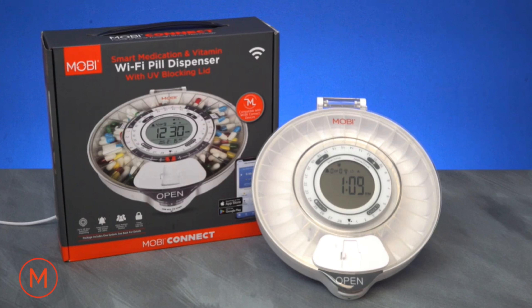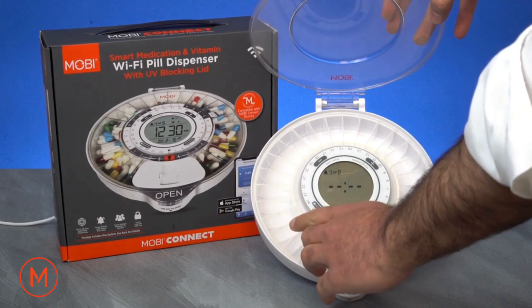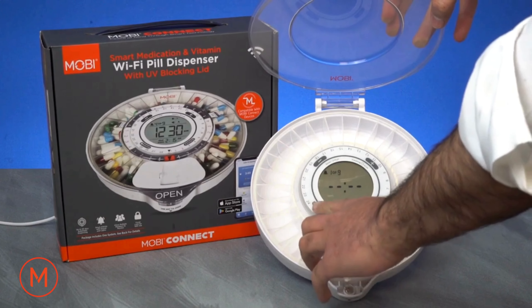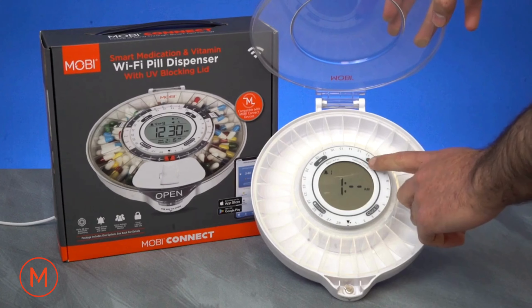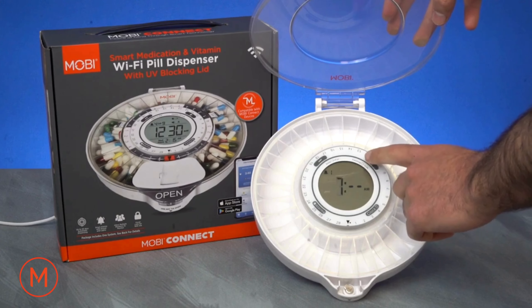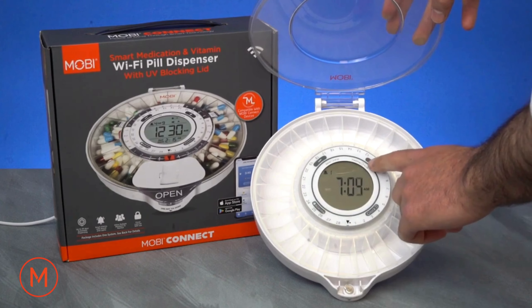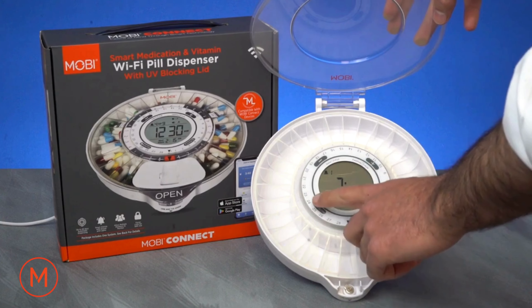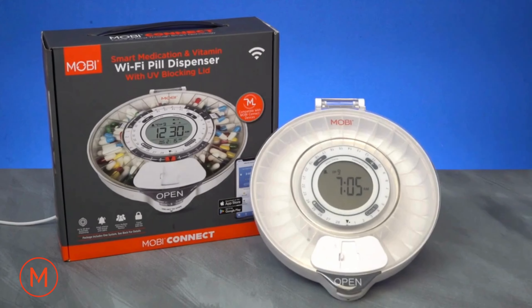I will now demonstrate how to set up your pill dispenser manually. First, ensure the pill dispenser is powered on. Second, lift the protective lid and press the alarm button. Third, press the alarm button again and use the plus button to set the hour first. Press the alarm again to set the minute. Using the plus and minus buttons, you'll be able to set your specific hour and minute, then finally press the alarm button once more when finished.